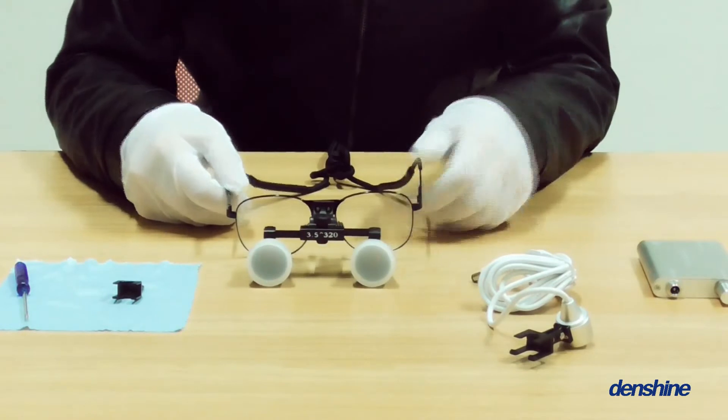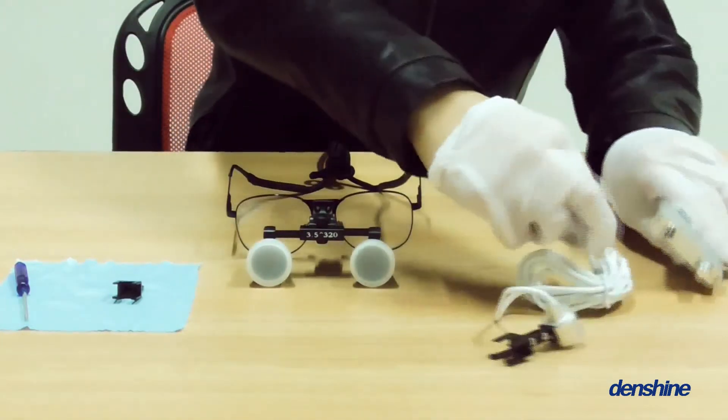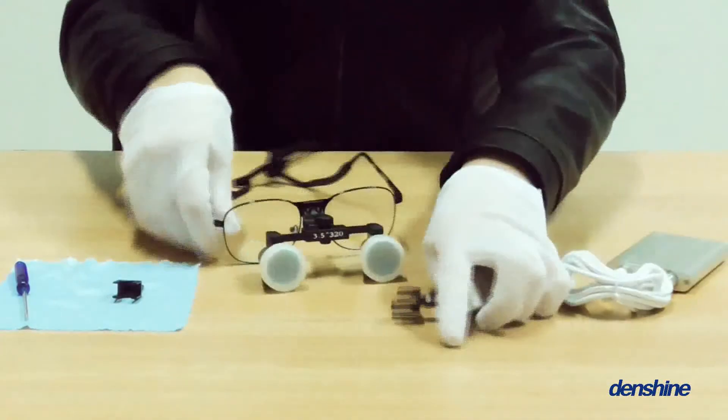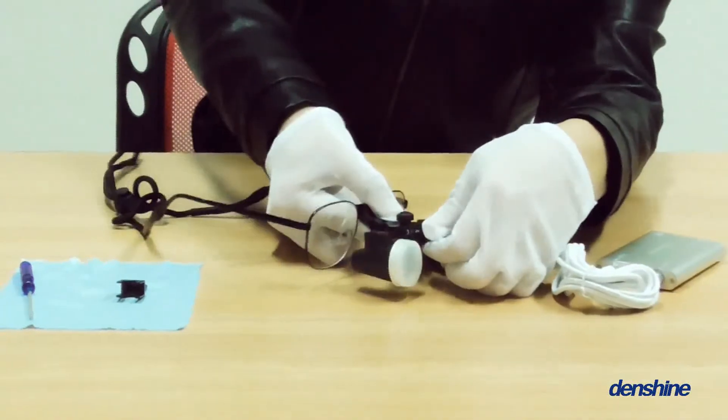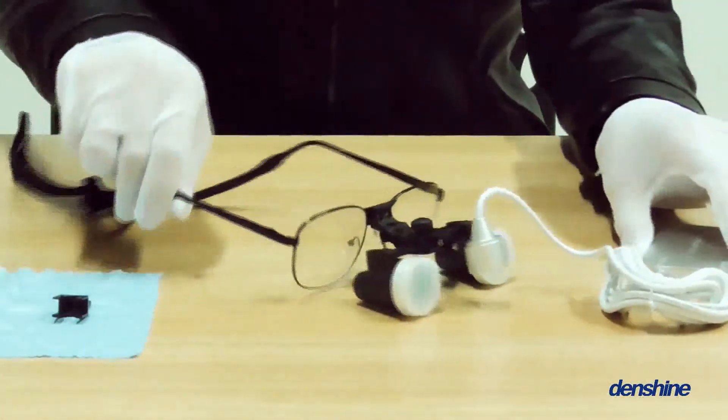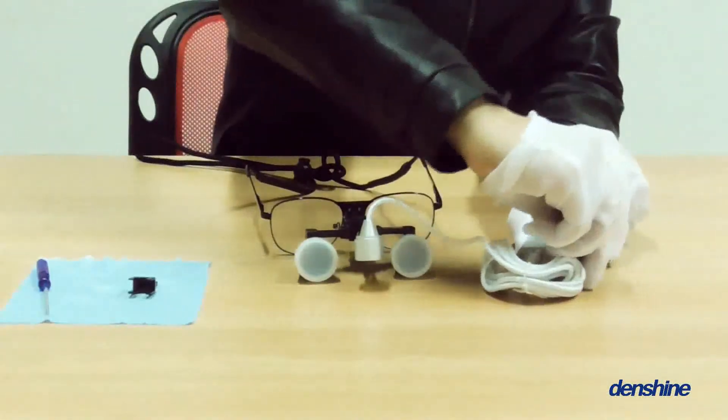Finally, couple light with loupe. Turn on the light and set it on the loupe. Be careful with the light when you adjust it. The light helps us see the object clearly and in detail.